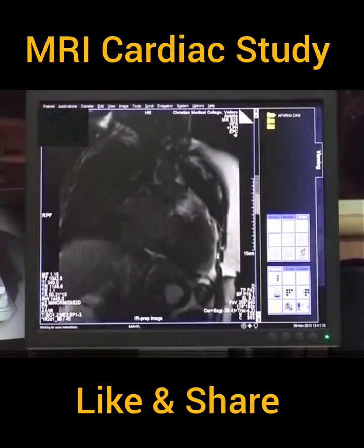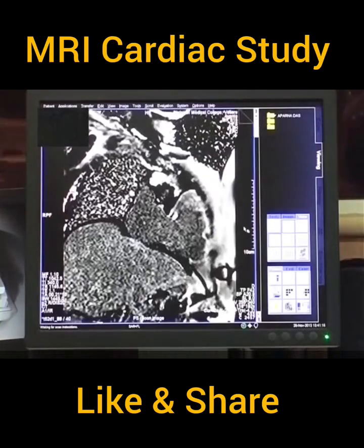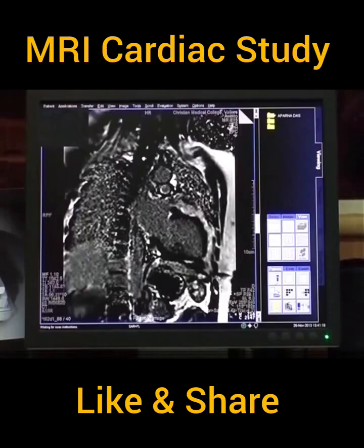Note the optimal nulling of the myocardium. With this sequence, the study is over. The images are transferred to the workstation for calculation of the RV and LV function.